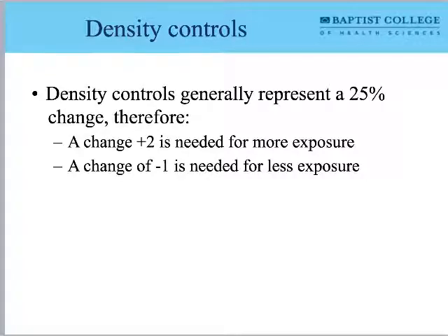Back in the day of film, the main reason you got paid the big bucks was twofold. The main reason you got paid the big bucks was knowing how to limit occupational and patient exposure, and knowing how to make a complicated film picture. The pictures were very, very tricky to make. They required a knowledge of chemistry. They required a knowledge of radiation exposure. You need to know your techniques really, really well. You had to sit and do technique calculations constantly to get a good picture. You could very easily overexpose or underexpose and get a crappy picture, and you'd have to go reshoot it.